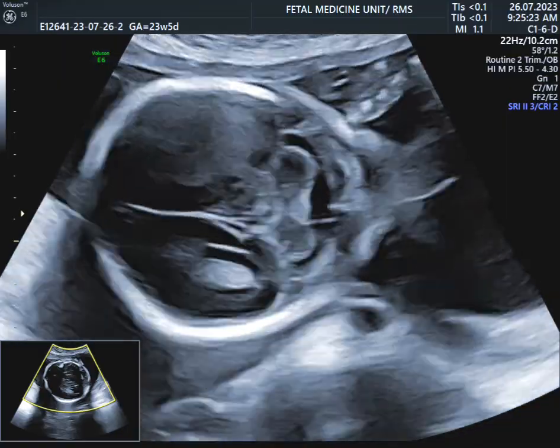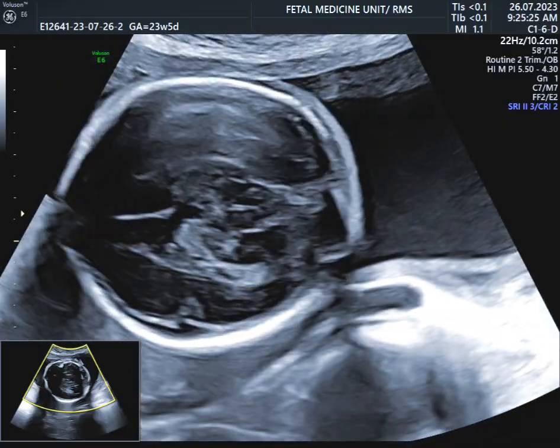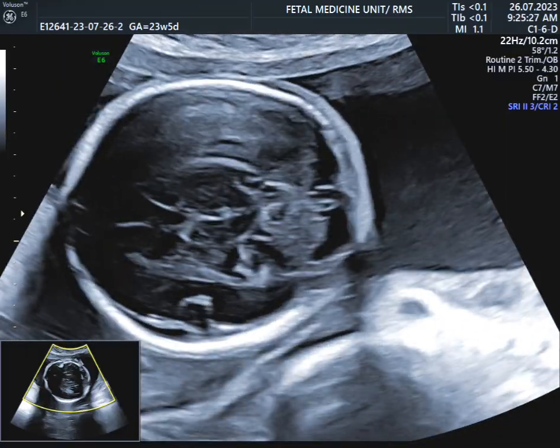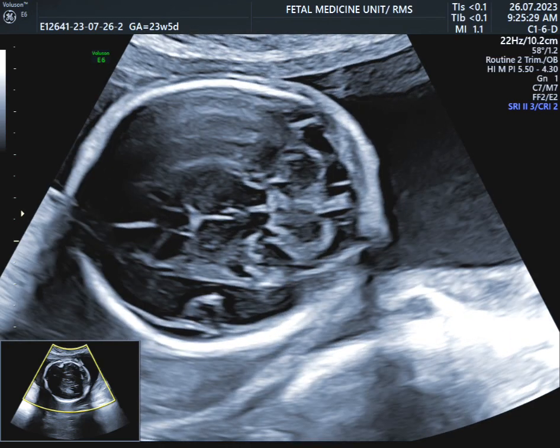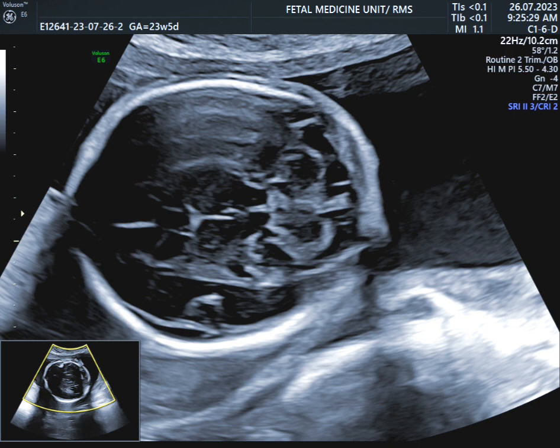And then it's very important to measure the nuchal fold. We can get the folds at this level and the cerebellum. Then we measure the nuchal fold. It should be less than 6 millimeters, and an increase of the nuchal fold is an indicator for trisomies or cardiac failure or risk for fetal death.